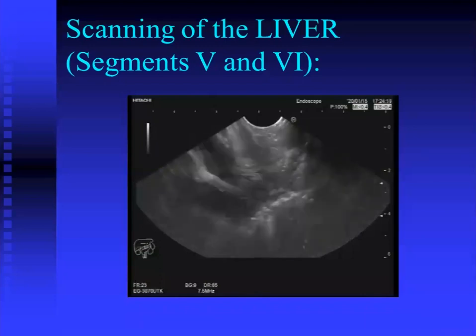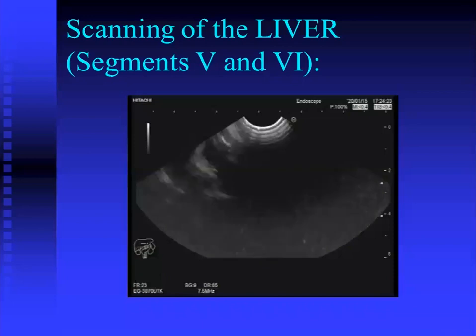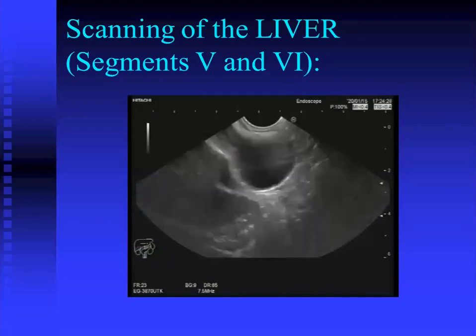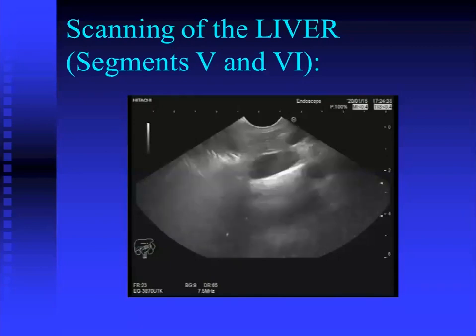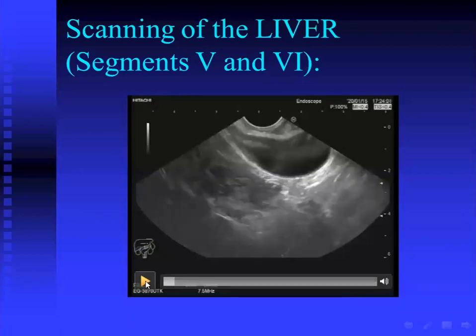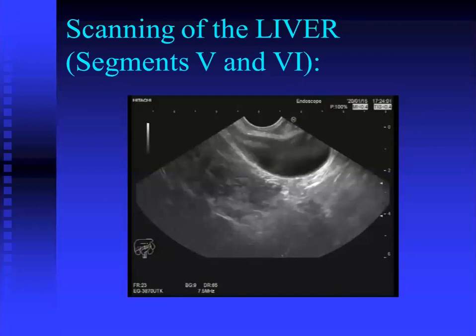I should highlight that we should see the liver thoroughly during EUS examination, especially in cases of staging of pancreatic or gastrointestinal malignancy, whether esophagus or stomach, because sometimes I can find a small hepatic focal lesion, likely metastasis, not seen by CT or MRI, and this will change the line of management of the patient from resectable tumor with major surgery by Whipple or distal pancreatectomy or so on, to palliative chemotherapy. So it is very important to examine the liver in every case.